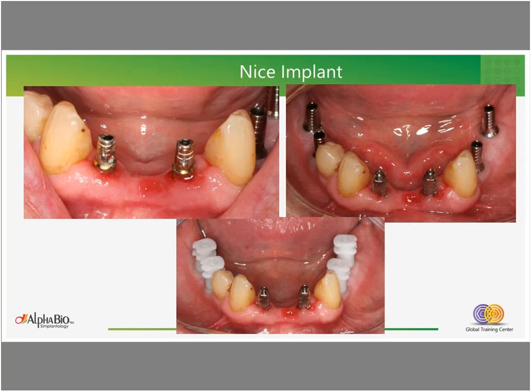integrity. In this case, we just need to replace these abutments with custom-made abutments in order to have a good shape and anatomy of the restoration. At the posterior area, where we have enough intermaxillary distance, we use the standard abutments in order to have a good anatomy of the posterior molars.